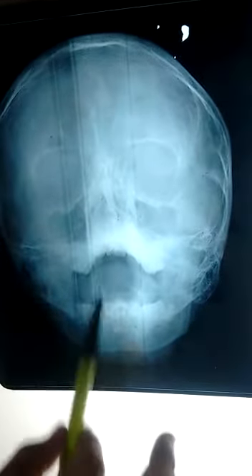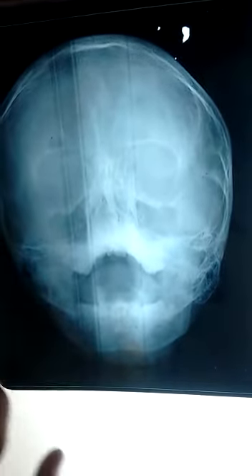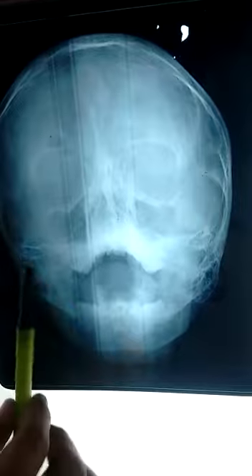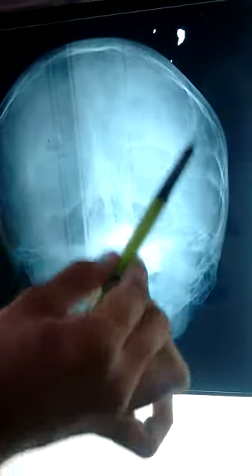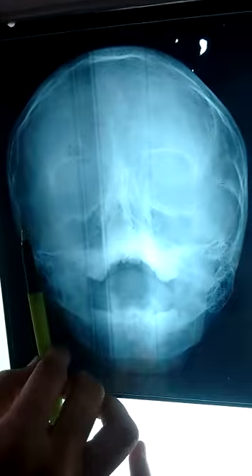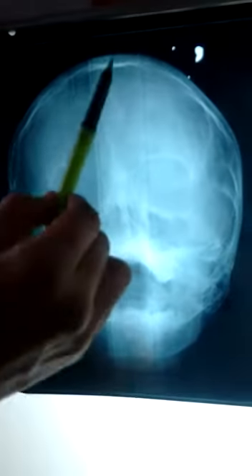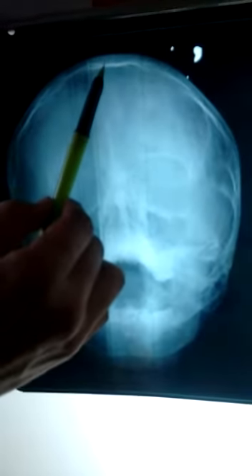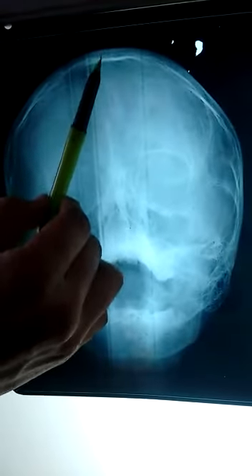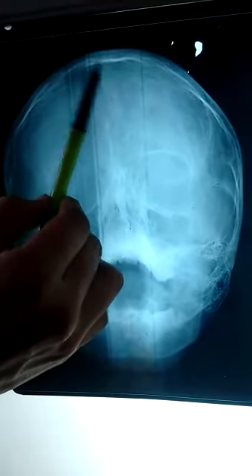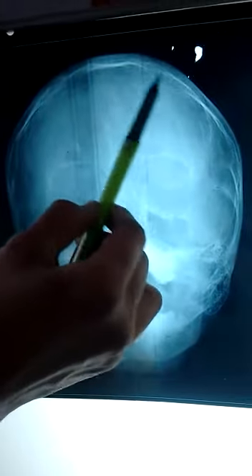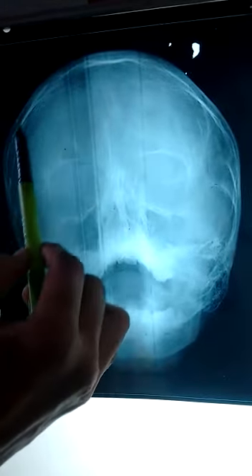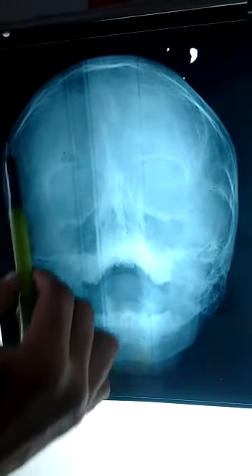In this view, the X-ray beam is transmitted at 45-degree angulation to the film, and the view is taken with the mouth open. You can also see the skull cap — the outer table and the inner table are the radio-opaque lines, with the intervening area being the anastomosing network.